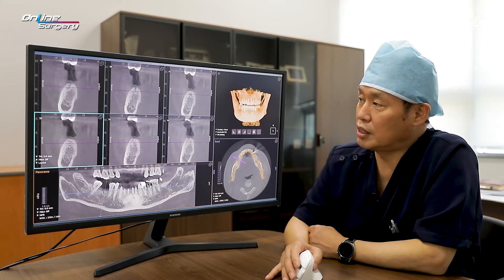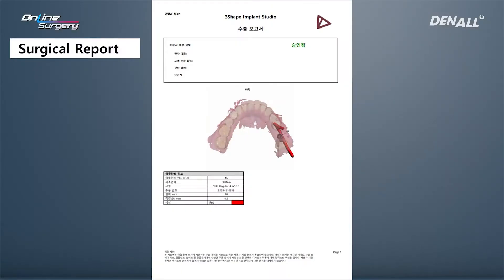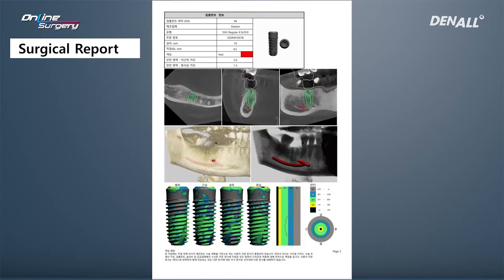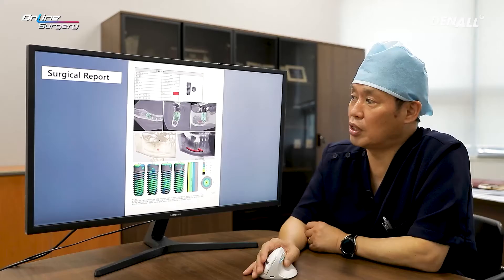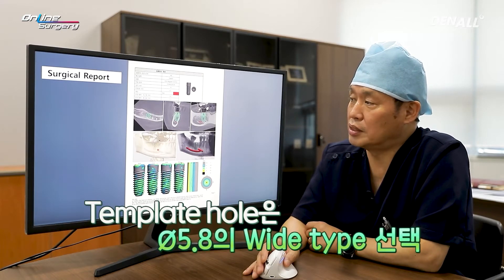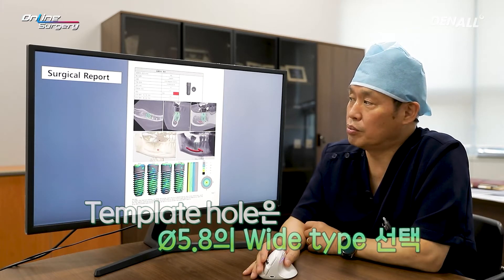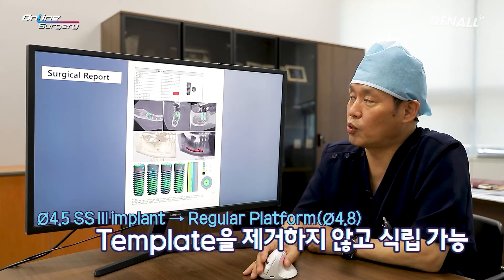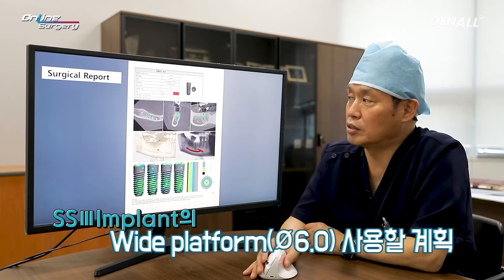We plan to use one guide template for guided surgery. A request was made to the one guide team and an SS implant was planned. Diameter 4.5 by 10 mm implant was planned originally. Because it's a posterior area, diameter was 4.5. However, the guide hole was wide type — 5.8. If you are to use regular platform, you can just place it in the wide hole. However, we planned to place a wide platform and therefore the template was removed and placement was done.